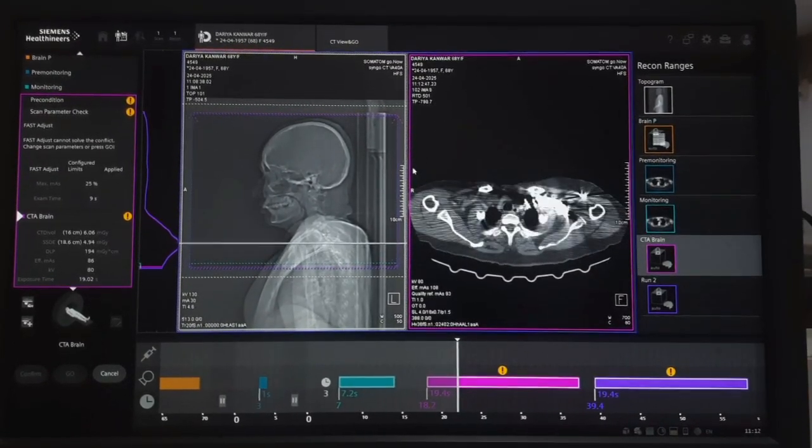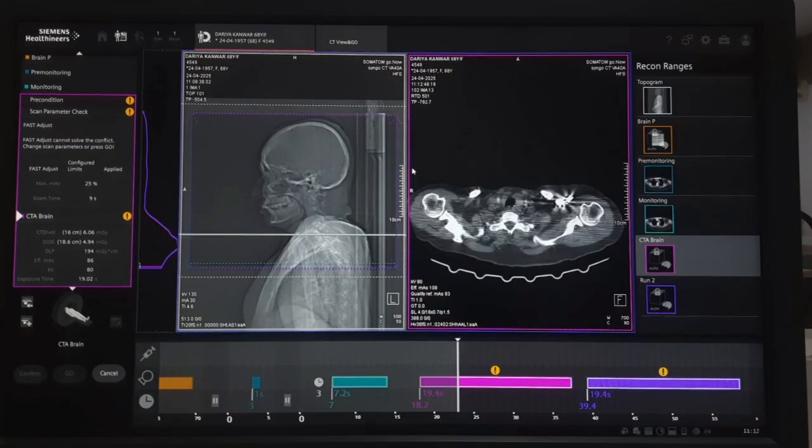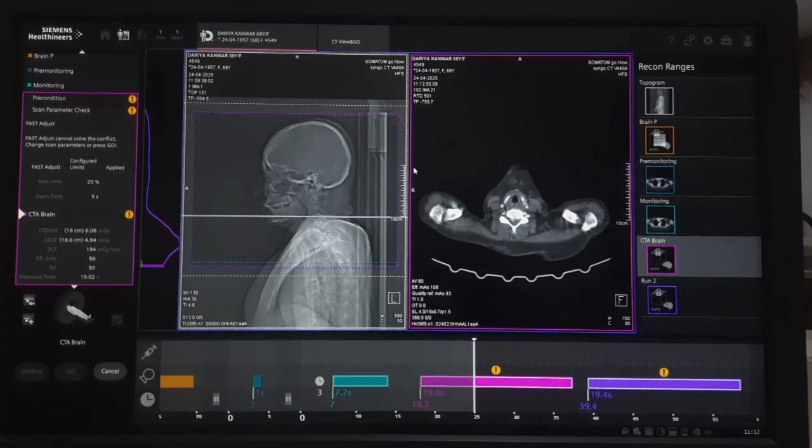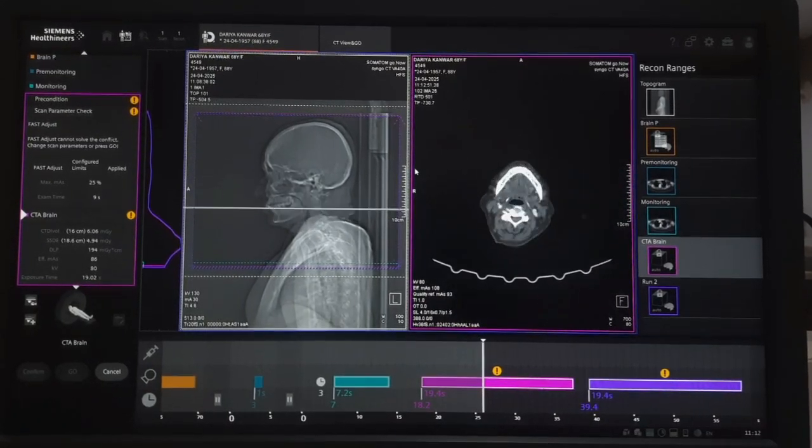This concludes the CT angiography of the brain and neck.